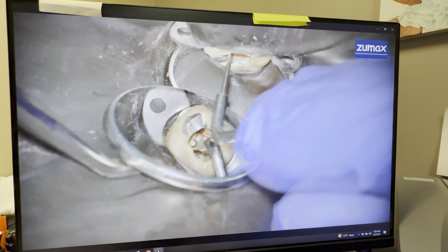Super Flexi Gold. All right, so these files, Super Flexi Gold and Easy Shaper files. You can get them from flexivodental.com. flexivodental.com. They're great files.